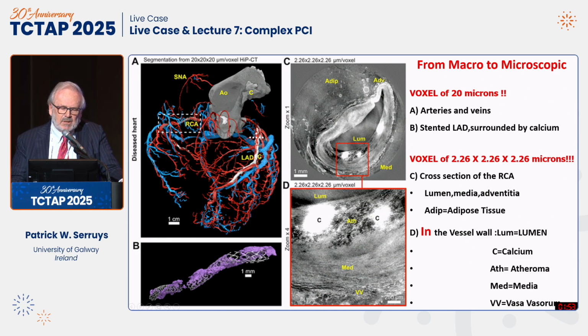And you could see here in the cross-section of this right the adipose tissue, the adventitia, the wall, the lumen. And here you see in this frame in red two small nodules of calcium with speculated aspect. So these are images which are phenomenal.